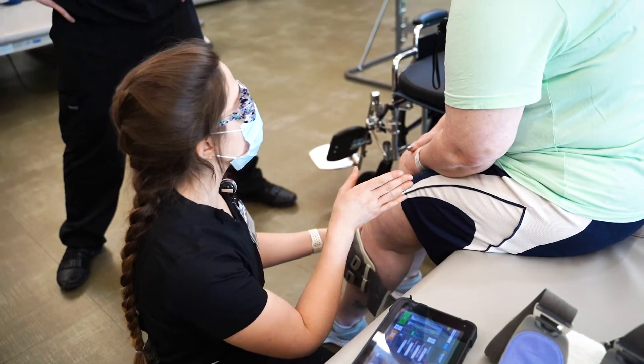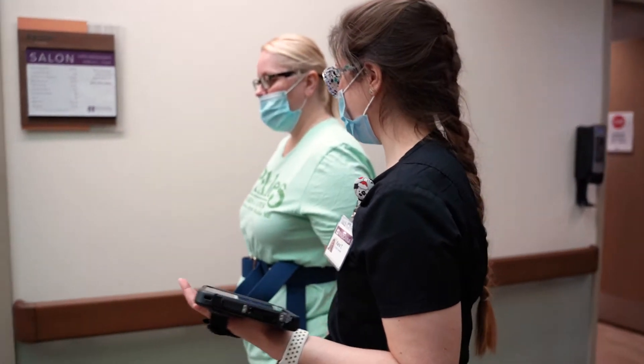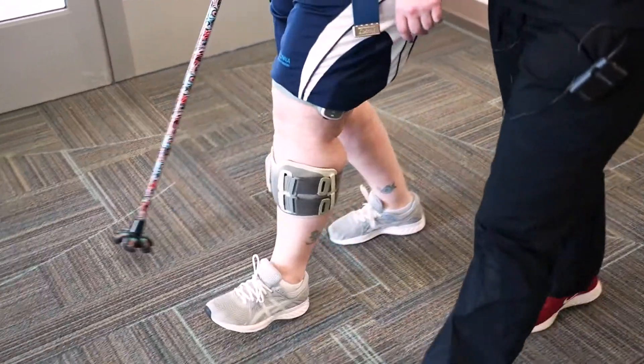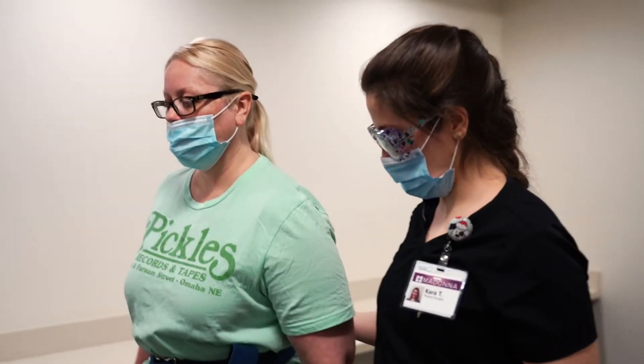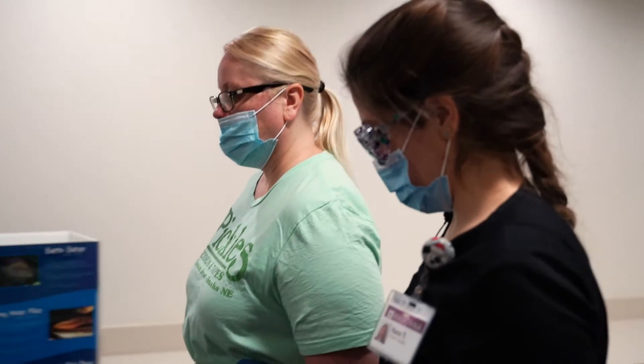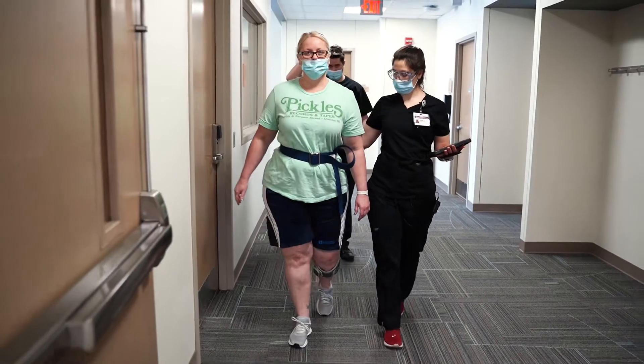The Bionis L300 is a machine that helps provide electrical stimulation to different muscle groups to help increase strength and independence. The reason that we chose this machine for Shannon is she has really great insight and awareness of what was going on with her affected leg. So adding something that helps increase that activation but also provides a cue for her to assist with that activation really helped increase her endurance.